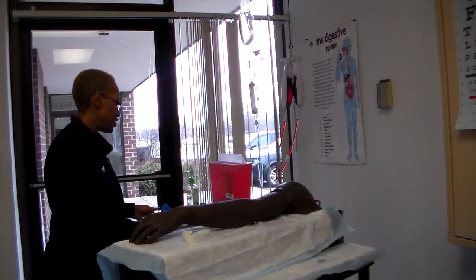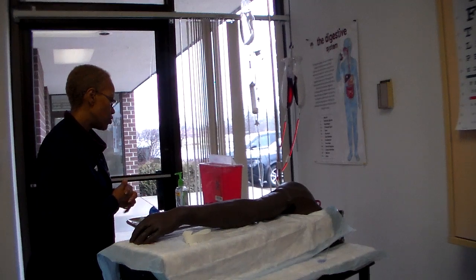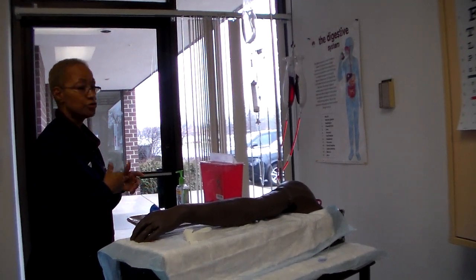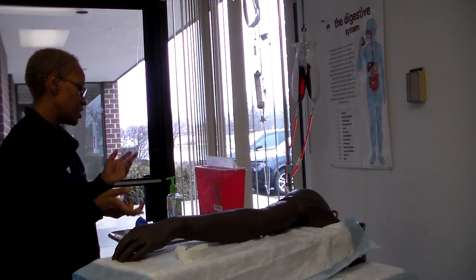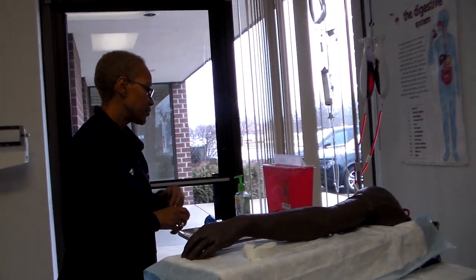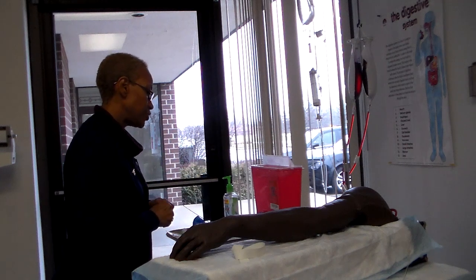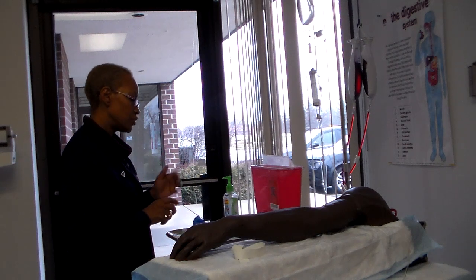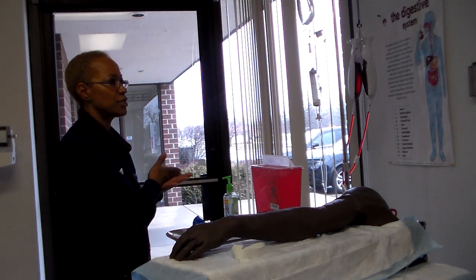Initiating IV therapy. First, you're going to review your physician's orders and make sure you have the right kind of medication fluid or IV fluid that the doctor is ordering. You're going to check the purpose of this infusion, the fluid that you're going to give, and of course follow the 6 rights while you're at your mark.